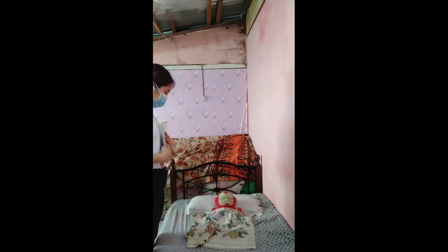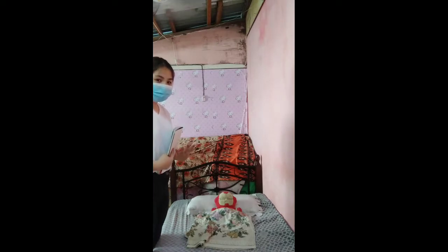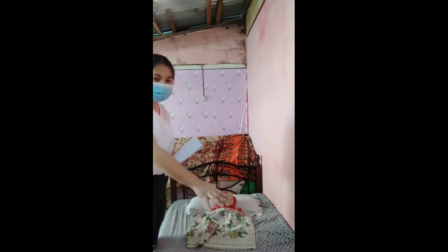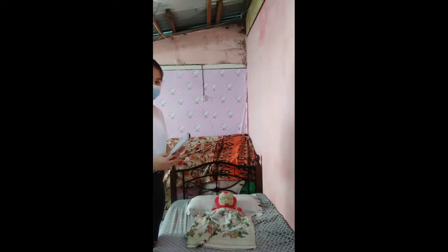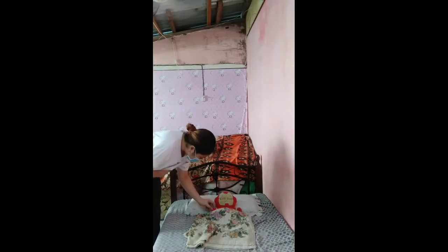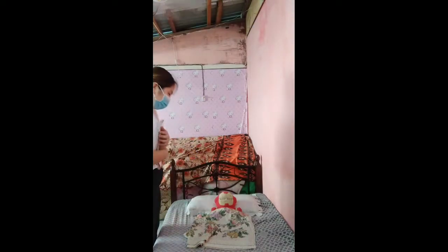So the next one is we need to prepare all the materials needed for catheterization. So I have here all the materials needed for catheterization. So the next step is identify the patient's name and ask her for any allergies she has. So, ma'am, what is your name? So you are Carmela Sumukat. What is your date of birth? So perfect. So, ma'am, do you have any allergies to food or seafood, or any allergies you have? So you don't have any allergies, so perfect.